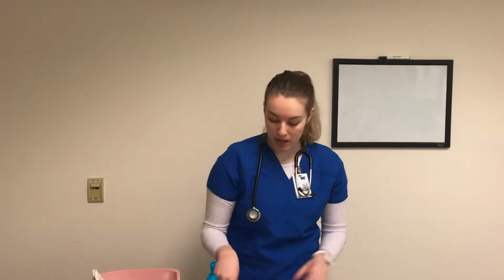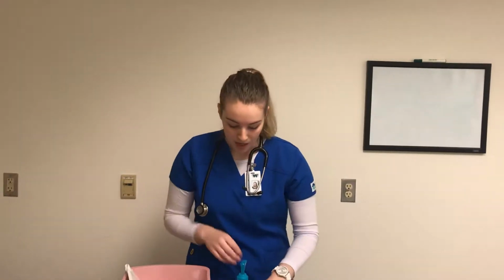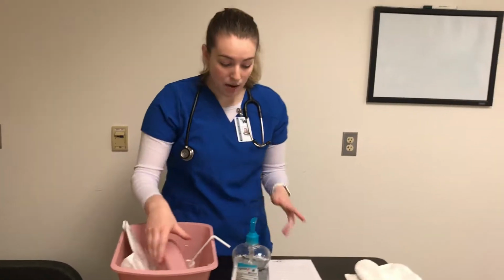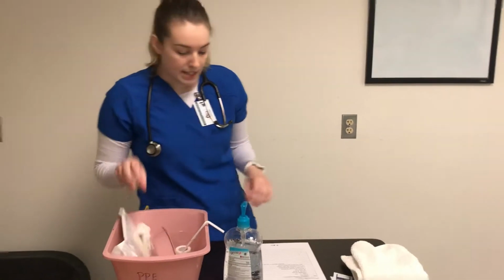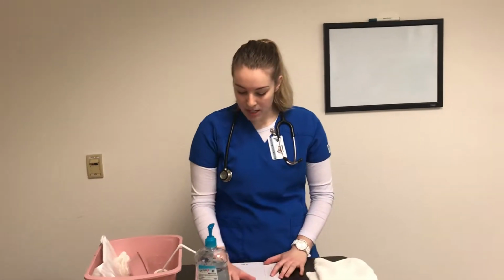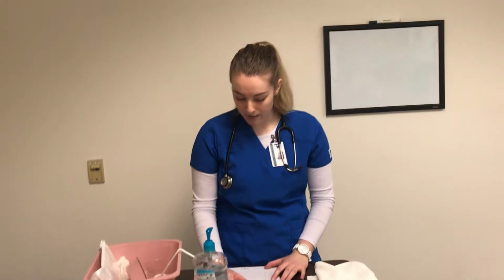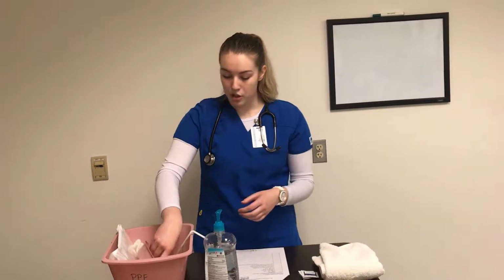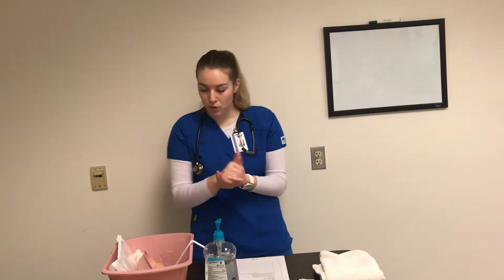I'm back in my med room and I'm just going to clean up my space a little bit as I prepare to remove the NGT tube. So I'm back in my med room and I now have a new order for Shirley. I see that she's been hooked up to suction and her pain must be managed, so we're going to remove the tube. So again, I have patient Shirley Coast, date of birth 5/14/64, Dr. Leo, room 211-1, and we have an order to remove the NGT tube today. So I'm just going to perform my hand hygiene, and I've already gone over my doctor's orders, so I can make my way to my patient's room again.